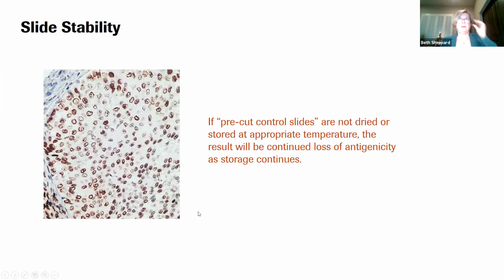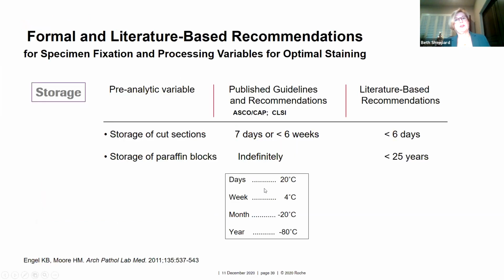Slide stability, people don't think about this too much, but pre-cutting slides does cause loss of antigenicity because of oxidation, so you need to store them at the appropriate temperatures. Here's a study that was done, with published guidelines as well as literature. Storage of cut sections should be 7 days, but less than 6 weeks.